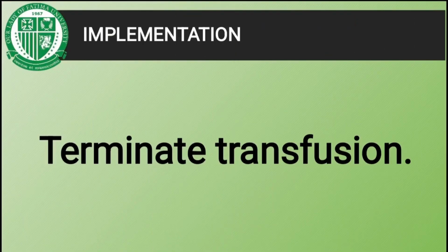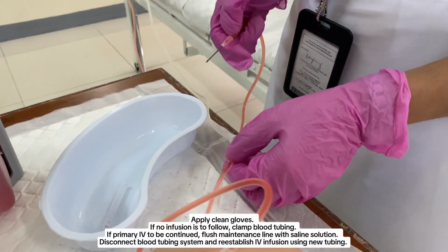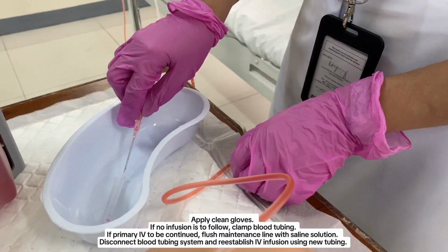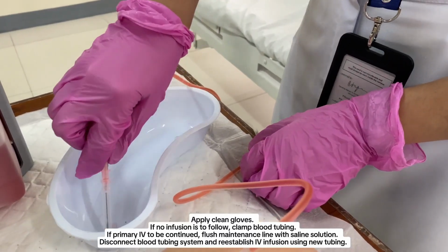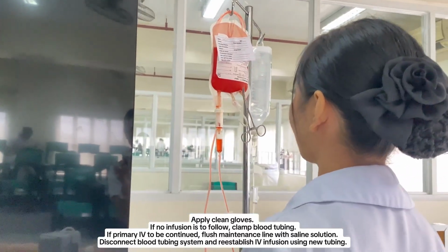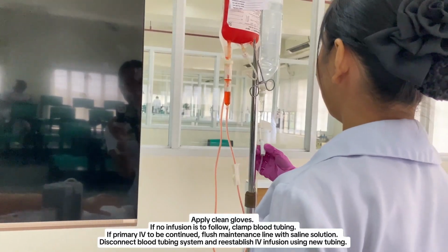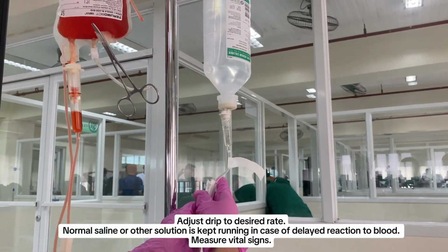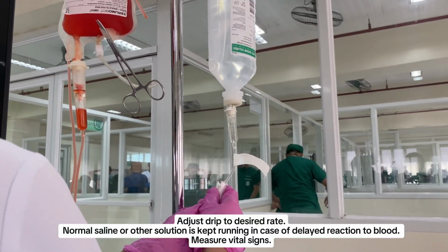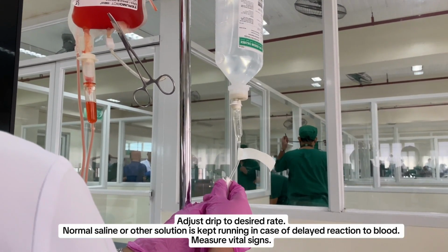When terminating the transfusion, apply clean gloves. If no infusion is to follow, clamp blood tubing. If primary IV to be continued, flush maintenance line with saline solution. Disconnect blood tubing system and re-establish IV infusion using new tubing. Adjust drip to desired rate. Normal saline or other solution should keep running in case of delayed reaction to blood.